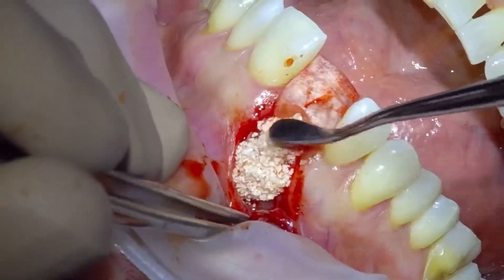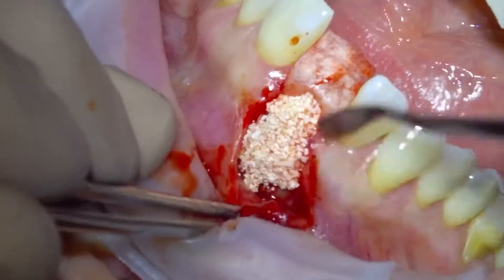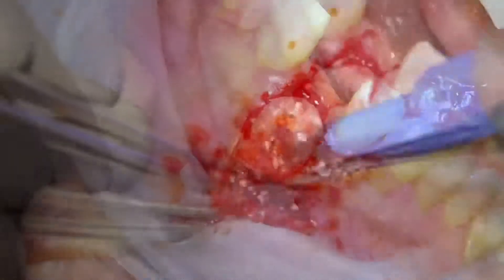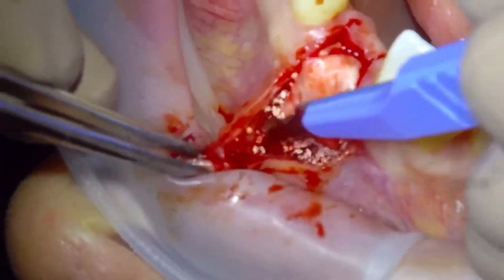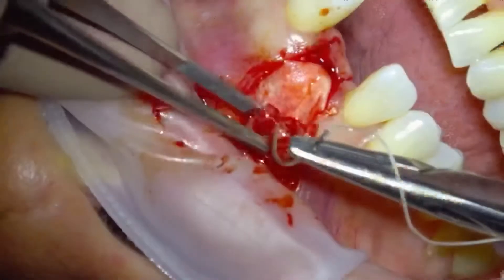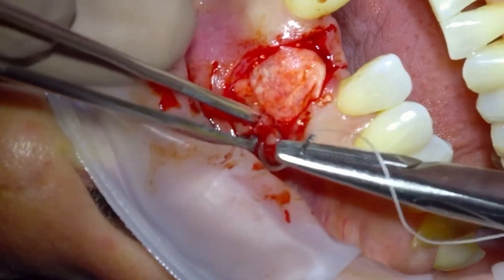As you can see, I've speeded up the video here. We just keep rebuilding until we get the desired ridge form. And then if required, sometimes we need to just add another little periosteal release, just to make sure we get passive tension-free closure.